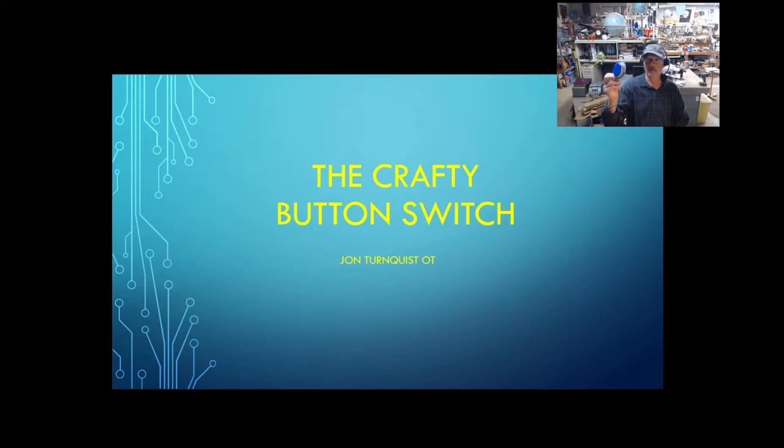And this is what I came up with. It's all 3D printed with the exception of the cable and parts. And I'll talk about how this whole thing's made now. But I didn't know what to call it. I thought about calling it the $5 switch, because that's, I think, less than $5 with the parts. I suggested the not-for-profit switch, but my wife said, you know, call it the crafty switch, the crafty button switch, and so that's what stuck. So let's get into how this is made here.